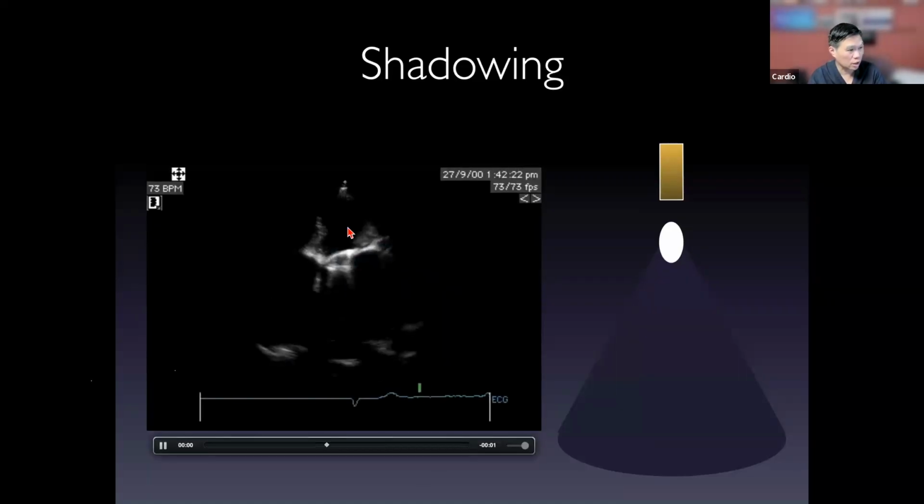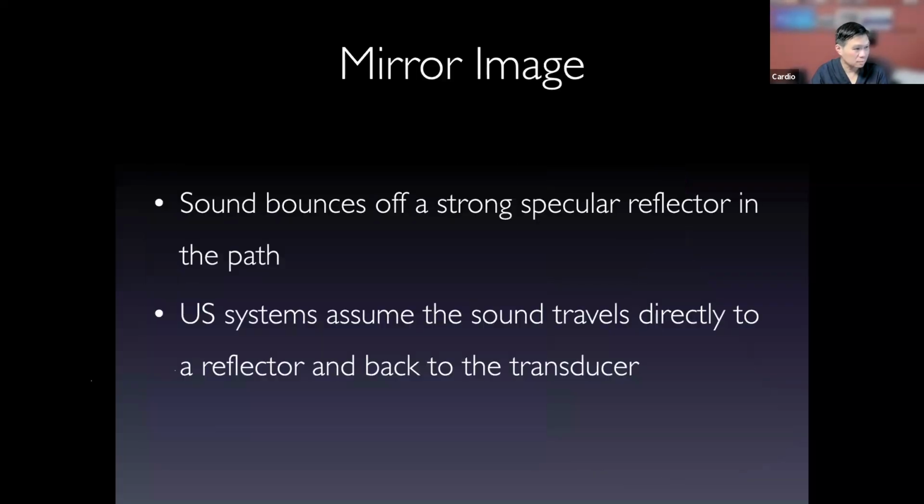This is actually the shadowing I was telling you about. You've seen this picture already. So that's a left ventricle that is kind of small. The left atrium is super large, but anything along this line, apart from the comet tail I showed you, you really shouldn't be able to see any mitral regurgitation or any mass in there because it's shadowed.